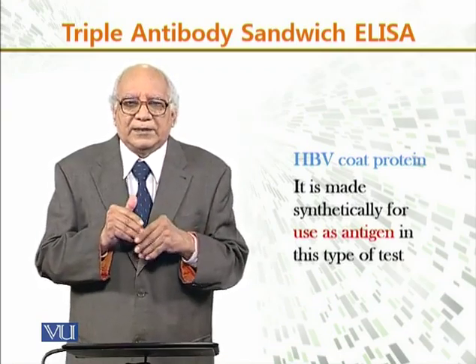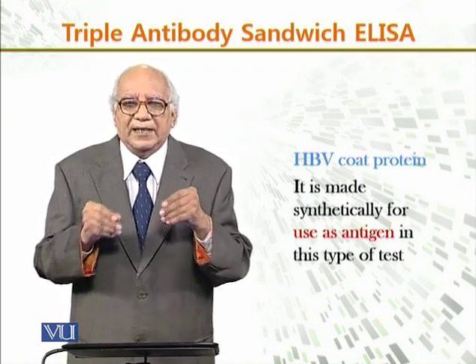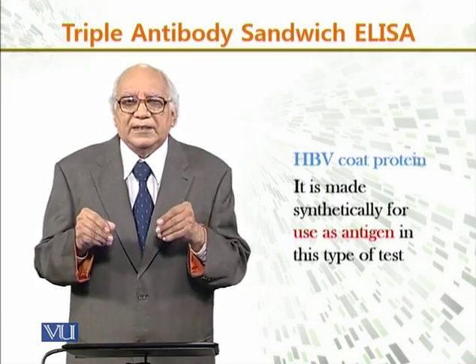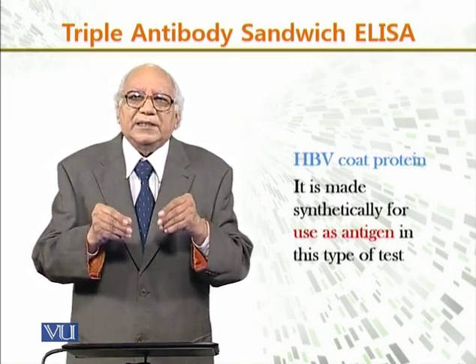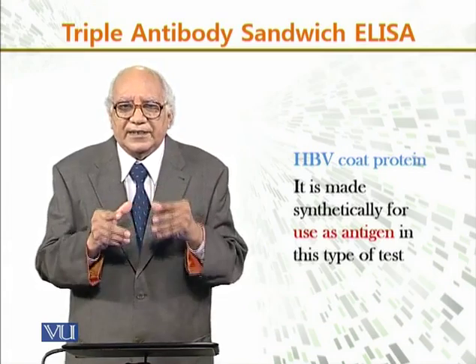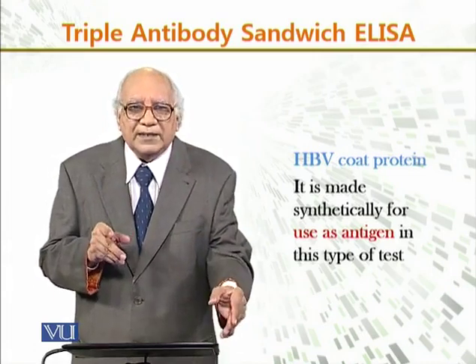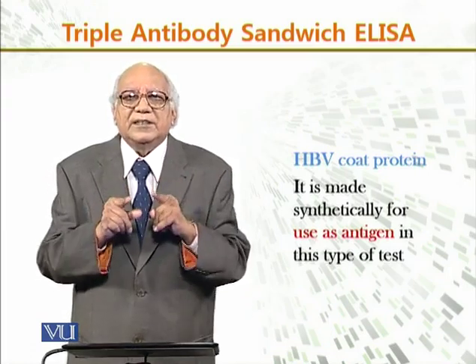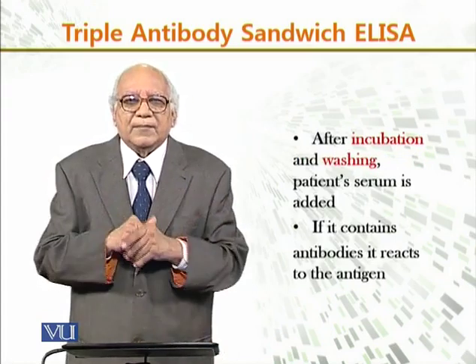HBV coat protein is made synthetically for use as antigen in this type of test. The HBV coat protein present in the virus is prepared synthetically and used for the test. Remember, the live virus cannot be used in this test; rather, the synthetic antigen is used.